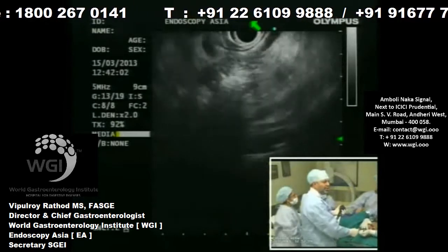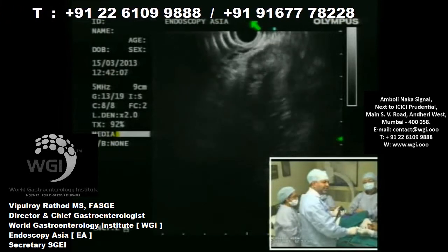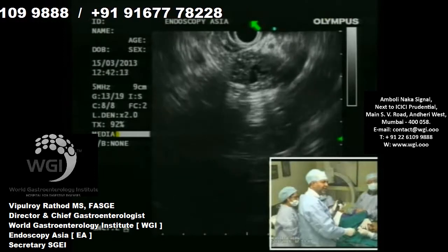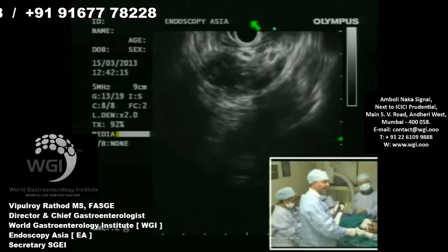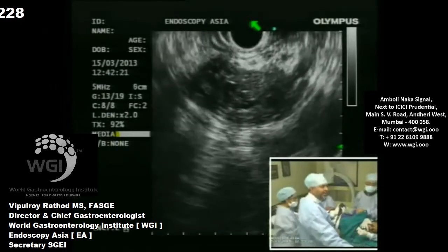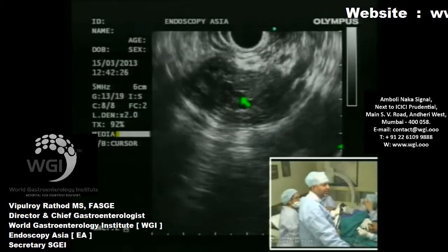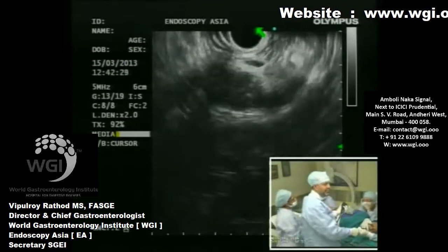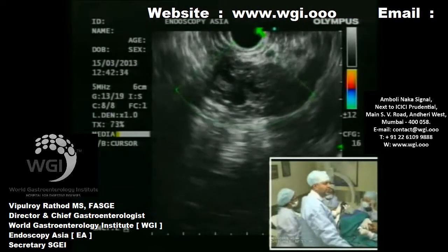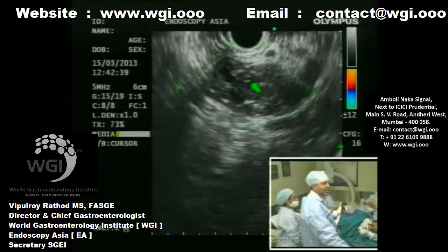Because we are coming close to our live webinar of today, we thought we'd share with you an interesting case, which is a diagnostic dilemma, especially in young patients. And I'm seeing a very hypoechoic pancreas. Look at this hypoechoic pancreas. I hope you can appreciate this is a very, very hypoechoic sausage-shaped pancreas with a dilated, irregular pancreatic duct. Now I'll put color Doppler on it to show you that we are dealing with ducts here. So this is the pancreatic duct, a tortuous dilated pancreatic duct.